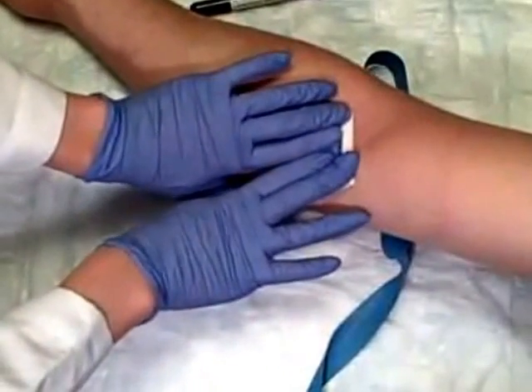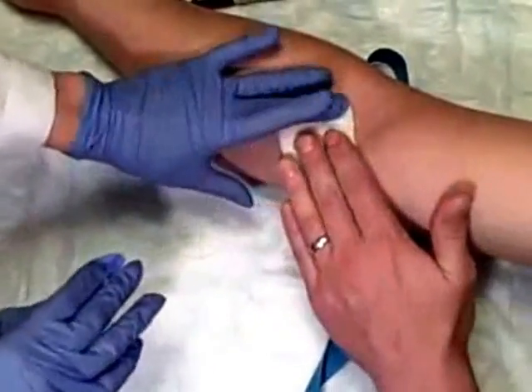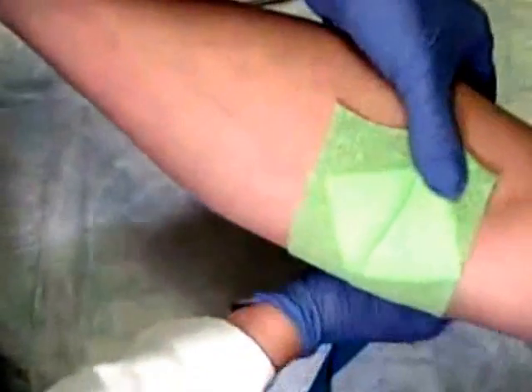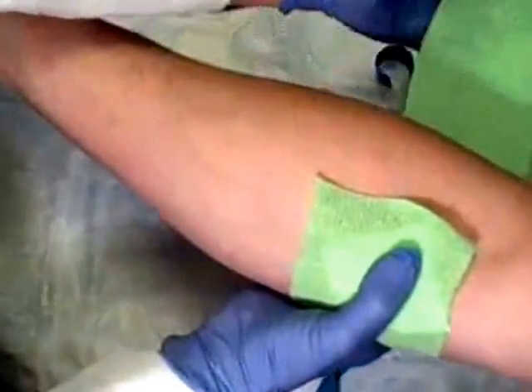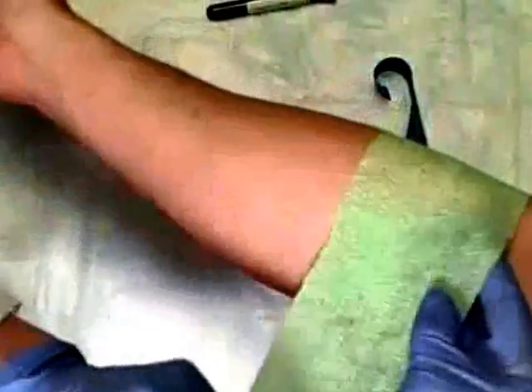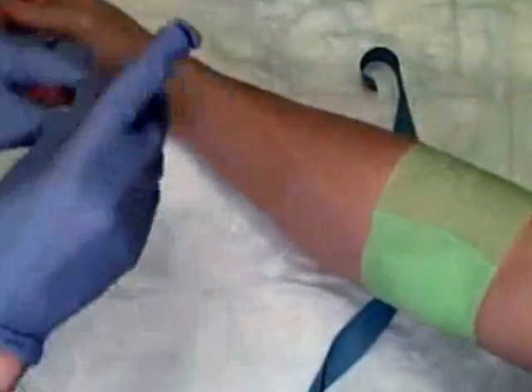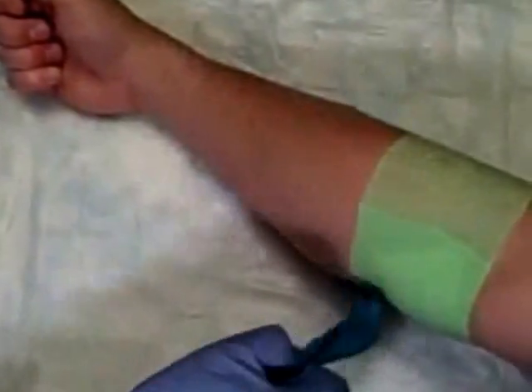I'm going to get my Coban ready and ask the patient to gently hold pressure for just a second. I've got a pre-cut piece here, so you can let go. Coban is kind of like an ace wrap but it's a little bit sticky — it sticks to itself without needing any additional metal pieces. Once you're done with the procedure, you want to invert your tube, label the blood, send it to the laboratory, and always clean up your area.